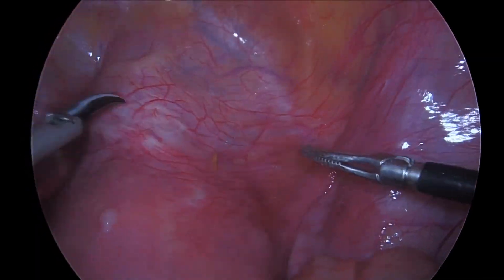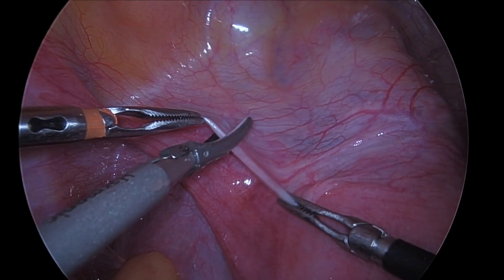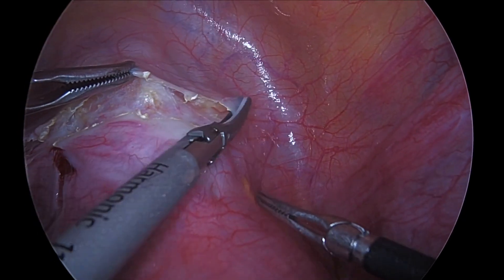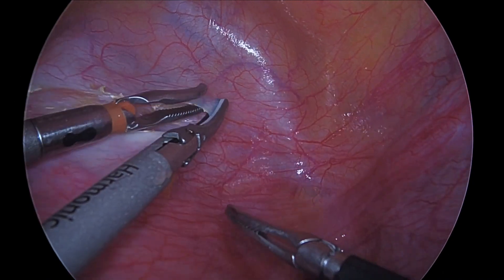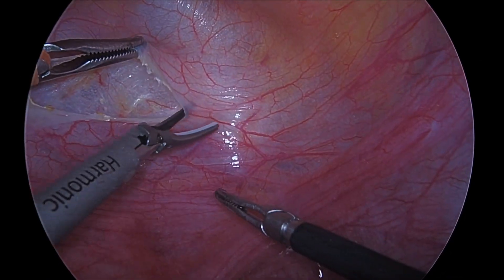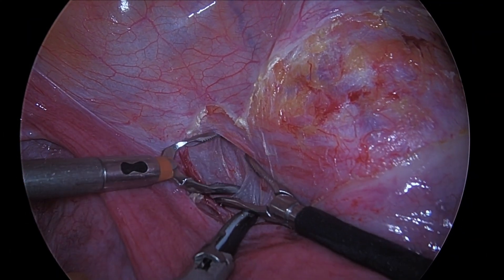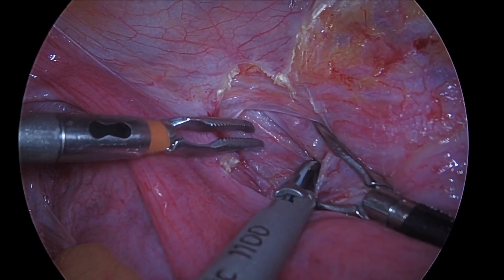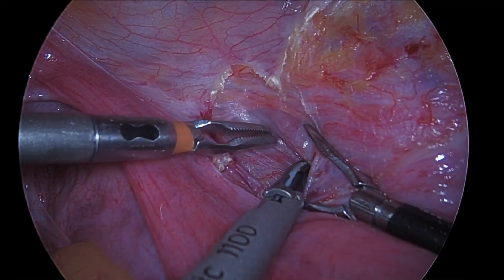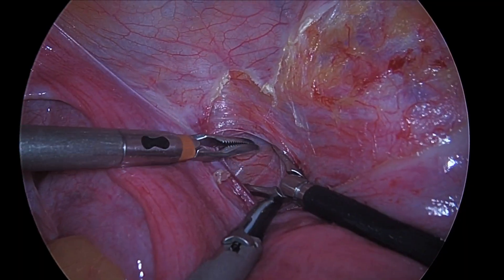After a thorough pelvic survey, the vesicouterine fold is tented upward and incised to develop a bladder flap. The peritoneal incision is extended into the broad ligament to allow for development of a broad ligament window and aid in uterine artery skeletonization. Uterine vessels are identified while creating a window in the posterior broad ligament. This window will aid in direct visualization of suture passage.